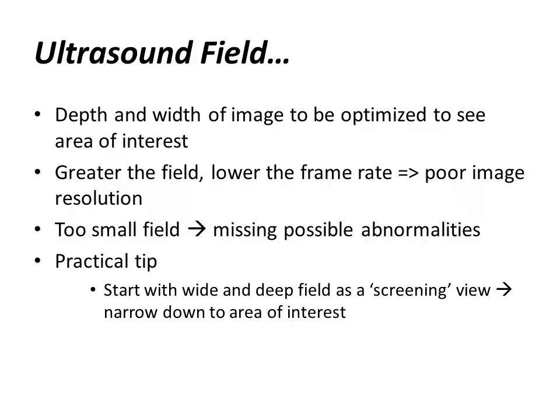Now we are going to talk about the ultrasound field. The ultrasound field is the ultrasound arc, if you like. So we're going to be talking about the depth of the arc that you choose and the width of the arc that you choose. Now, in general, you need to have the width and the depth optimized for the area of interest, and this is probably quite intuitive.